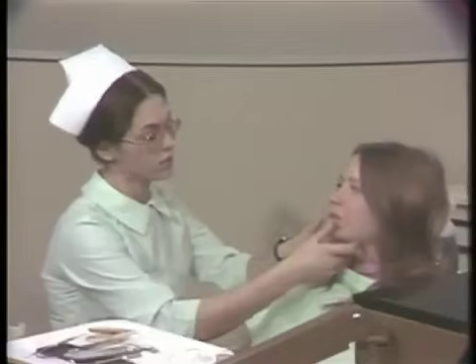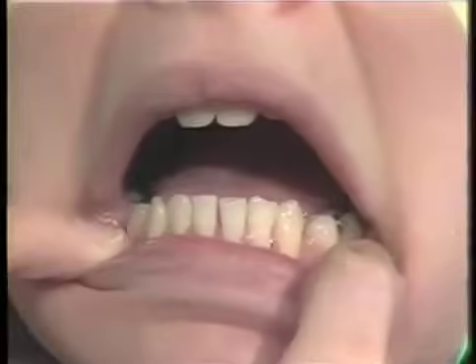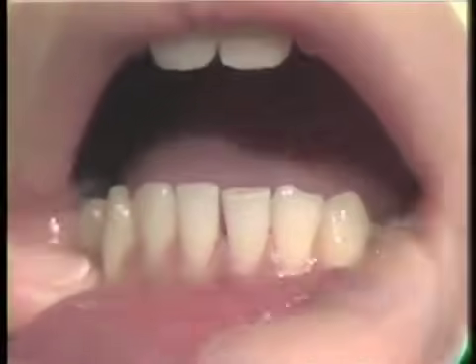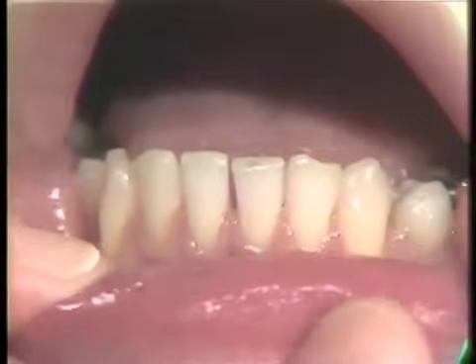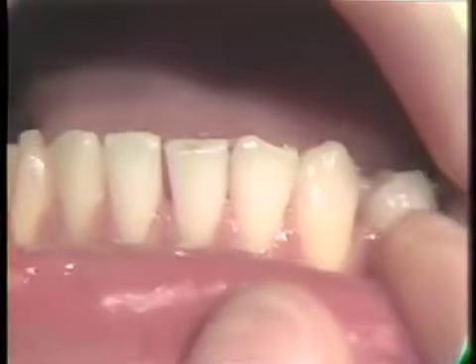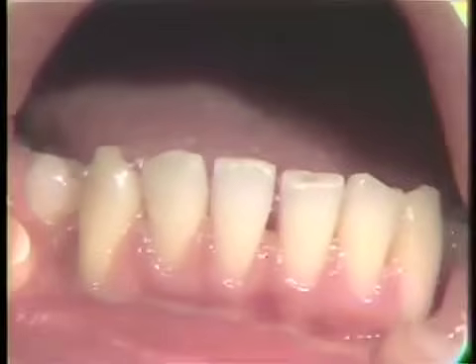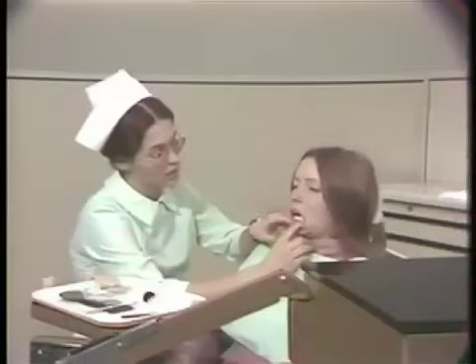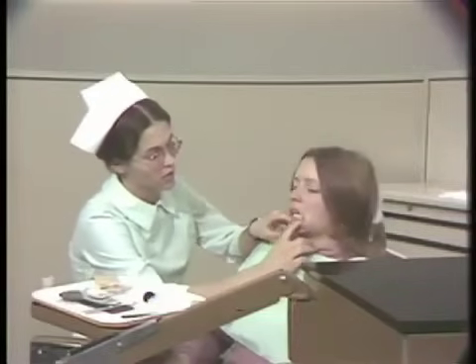Next, I'm going to check for wear facets on the teeth. Here you will notice the excessive wear on the mandibular anteriors. Notice the saucer effect on the mandibular left central and lateral incisors. Since these bottom teeth don't seem to be hitting on the upper teeth, it seems unusual that they should be so worn.